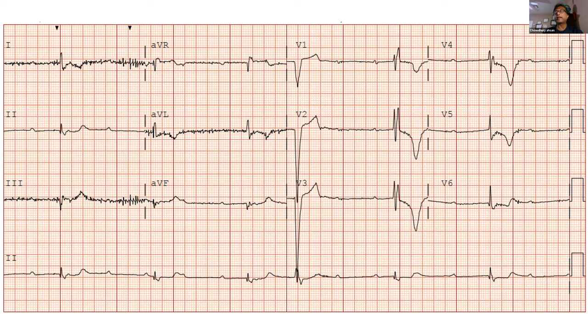Question now, where is the escape rhythm coming from, because there is no control of the atria over the ventricle now, and the ventricular escape rhythm is not coming from the junction. It is coming further down from the junction. So if it is not coming from the junction and is wide, then it is the Purkinje system, very infranodal. An infranodal block is very unreliable. So therefore, it is important to pace this patient.